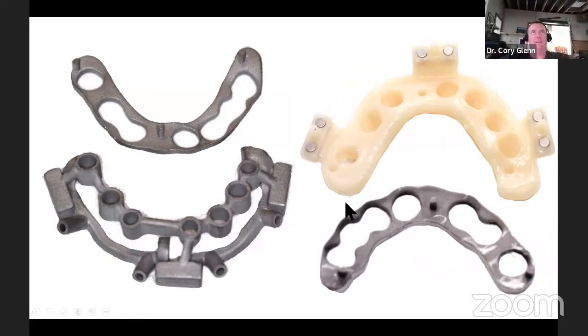The thing I finally discovered when I actually got to be clinically present in a couple of these cases was, even when you're doing guided surgery, sometimes you end up with a crappy implant site and you don't have primary fixation, and maybe you move to a different site, or maybe the doctor doesn't fully guide the implant into place, and so the trajectory ends up a little bit off of where it was anticipated to be.